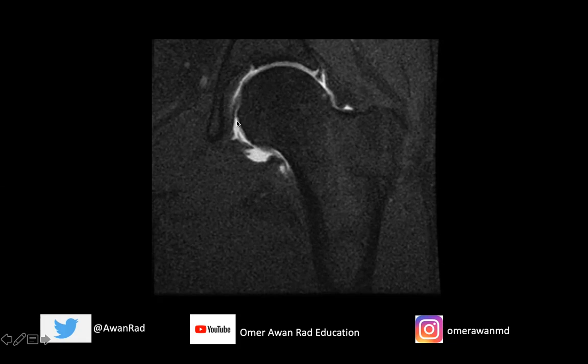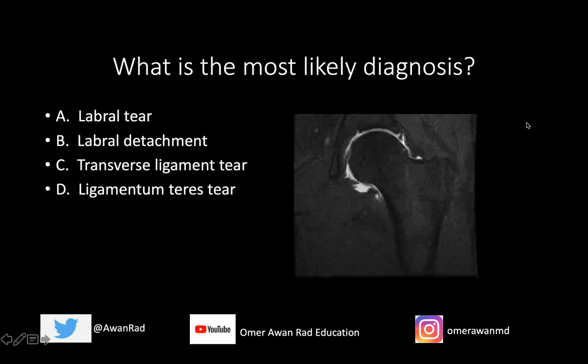We look for intra-articular pathology — maybe a ligament within the hip, things that are within the intra-articular space that we don't see on a conventional MRI hip. It's a very exquisite and neat study to evaluate intra-articular structures, and the joint is distended so we can see those structures much better. We're seeing a coronal T1 fat sat image through the left hip, and the question is: what's the most likely diagnosis?